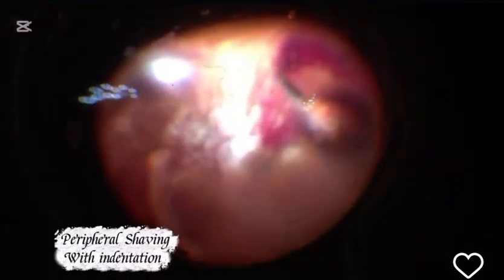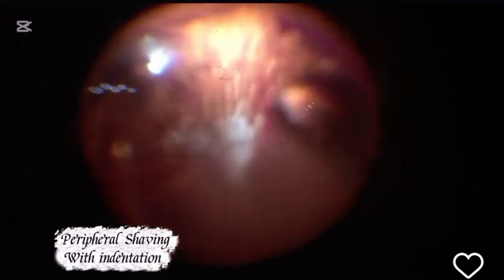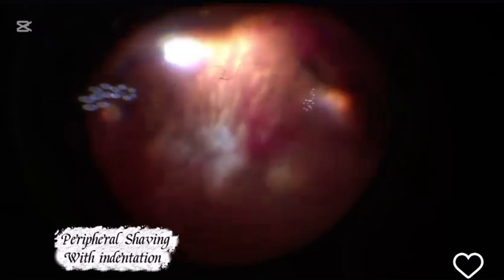Luckily, this is, as I've mentioned earlier, a myopic case, so PVD in most myopic cases, as we all know, has been induced. Continue core vitrectomy. Check the bleeders. There is no more bleeder.